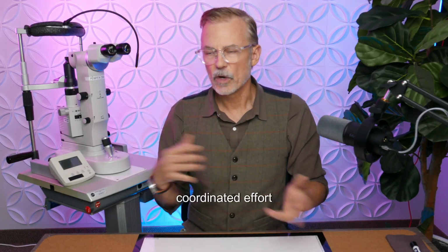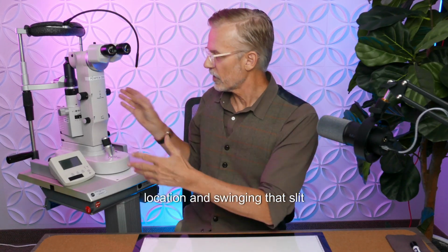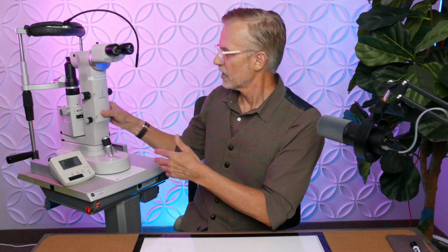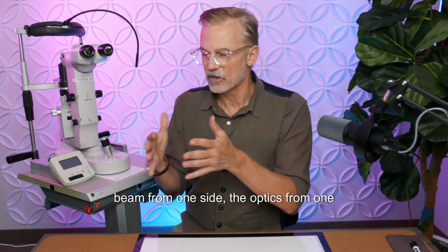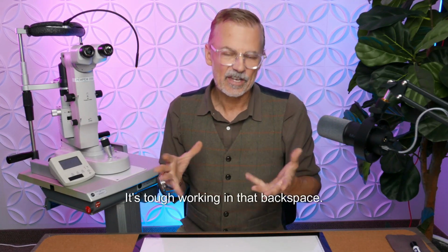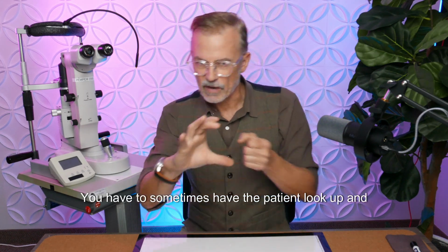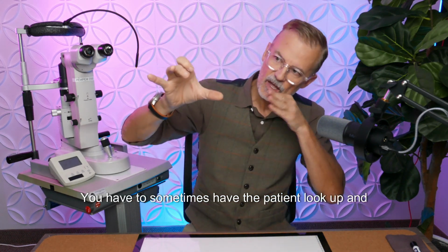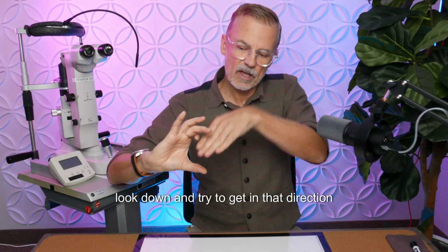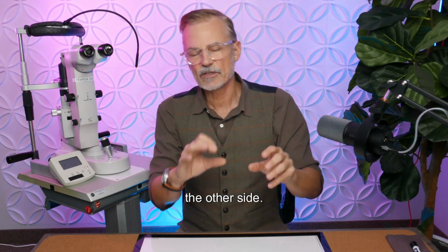Mostly you're putting that energy where you want to deliver it. It's a coordinated effort between the patient and the doctor and the location, swinging the optics and the slit beam from one side to the other. It's tough working in that back space. So it is not just moving it where you want to. Sometimes you have the patient look up or look down, swing the laser over a little bit, and maybe have the light off to the other side.